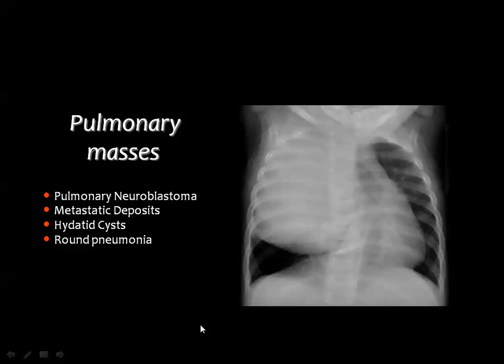One of the best ways to have this information is to do a chest ultrasound. And this chest ultrasound is very, very good in the pediatric age group, considering this differential diagnosis. You know that ultrasound is free of radiation. Ultrasound is cheaper than CT scan. Ultrasound does not need the injection of contrast material, and ultrasound can be performed as a bedside technique. Then it is a reliable diagnostic way to separate the solid from the cystic masses.